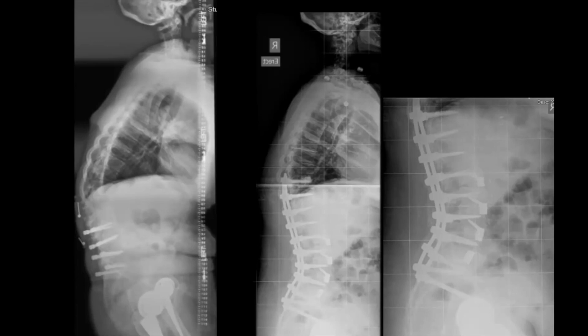So I'll do my discectomy, and oftentimes in a patient with a really collapsed disc, that'll involve taking down the posterior longitudinal ligament and the annulus off the end plate below. I'll get my posterior height first, and only then will I dial in my lordosis. And I think that the Innovasis instrumentation kit has some very nice tools that allow you to shim up sequentially with the posterior height first. I'll start maybe even with a 4 millimeter shim to get my posterior height. And then I'll dial in my lordosis after getting my posterior height.